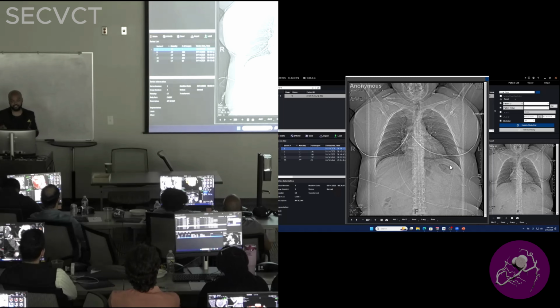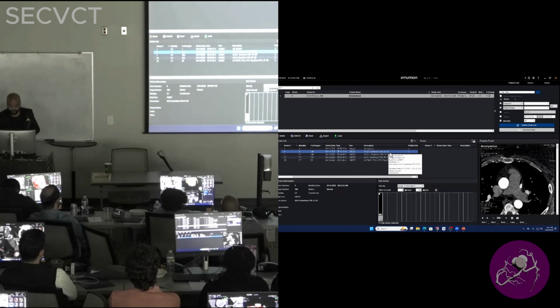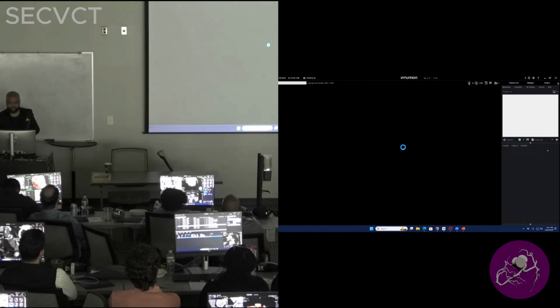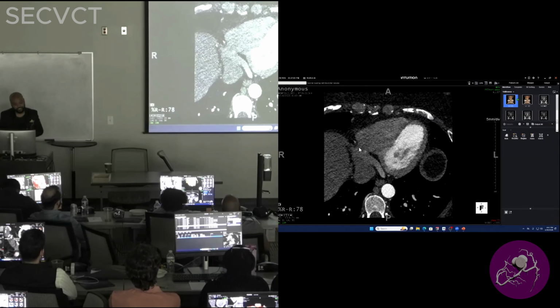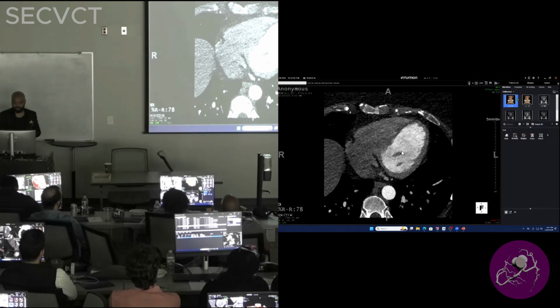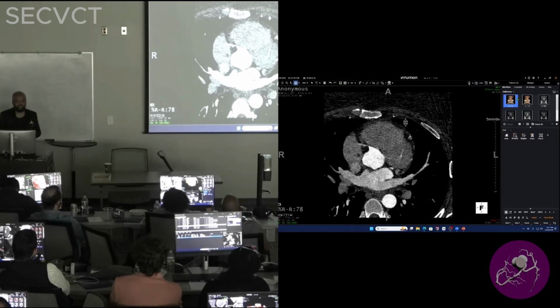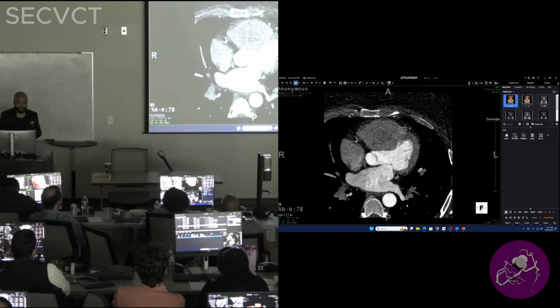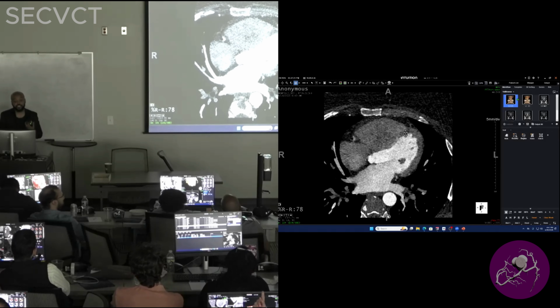The streak. Okay, so this study is not going to turn out too good, but with the power of our little photon counting CT, we can see why this CT is great and how it's able to do some work, but it can't really fully surmount everything. So optimizing for your patients, figuring out, okay, if I have a larger patient, where am I going to get them scanned? I would probably do our photon counting and then making sure I definitely remove the bra, and then giving a tighter, larger bolus if I can.